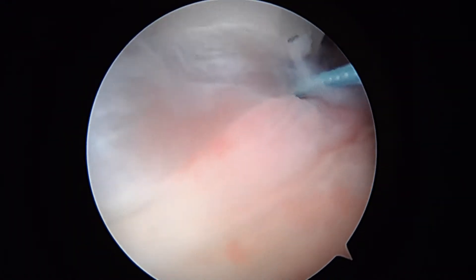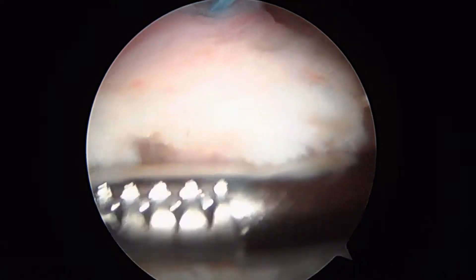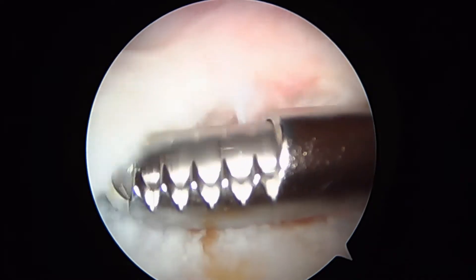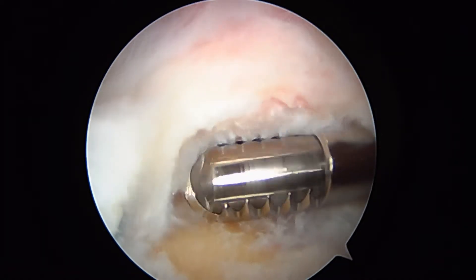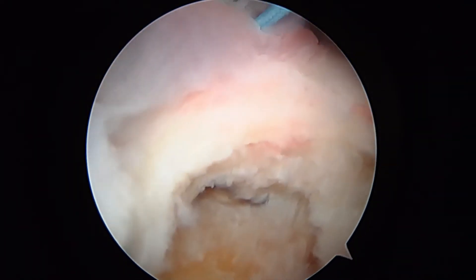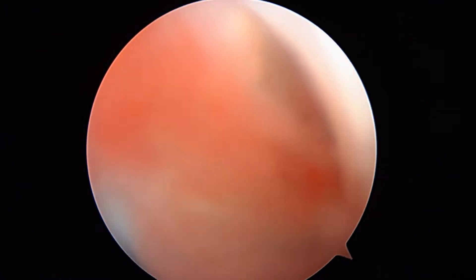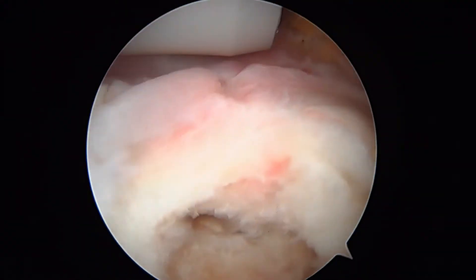Here's the tear right there. We've opened it up to make it a predictable repair. One set of sutures we don't need anymore since we're going to anchor this down to bone. We'll use the black and white sutures as our ripstop suture — there you can see the tear right there. What we're going to do next is take a spinal needle.